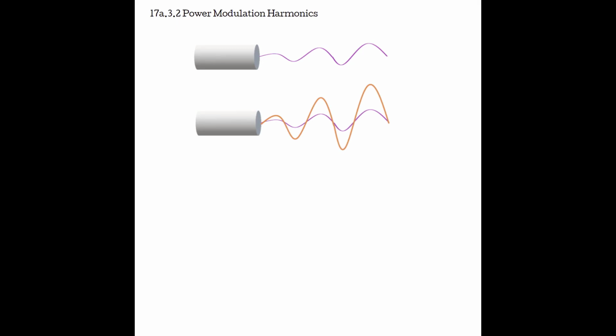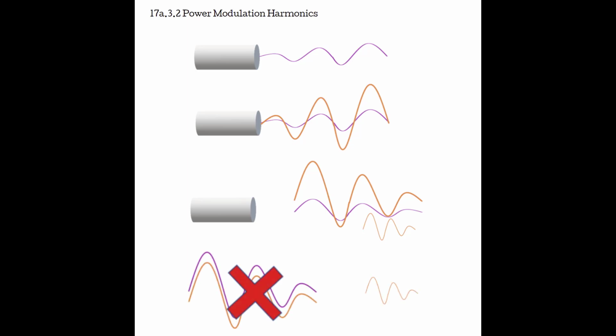So I have a visual representation of that as well. So remember, weak beam is sent in, a 2 times as strong, same frequency beam is also sent in. So we're using 2 pulses again per scan line. Those pulses are going to go into the body. Only the orange one, the strong beam, can create harmonics. So fundamental echoes come back from the strong beam, fundamental echoes come back from the weak beam, and the strong beam harmonics come back. Once they get back, the machine is going to double the purple one. So it figures out what matches up with the orange echoes. It's going to cancel all those out, and all we have left then are the harmonics that were created by the strong beam. Those then are used to produce the image. And that is tissue harmonics imaging.